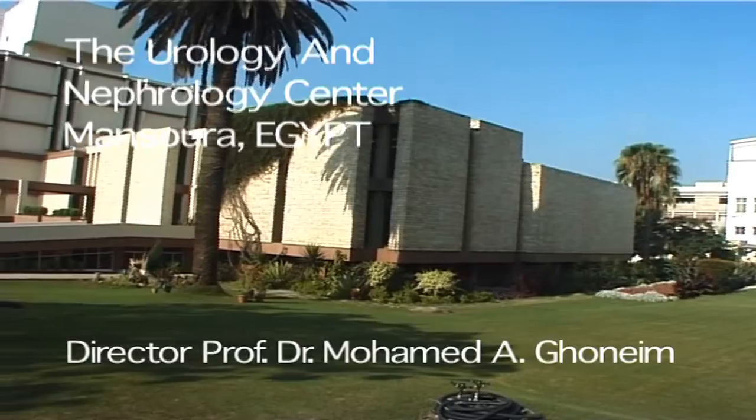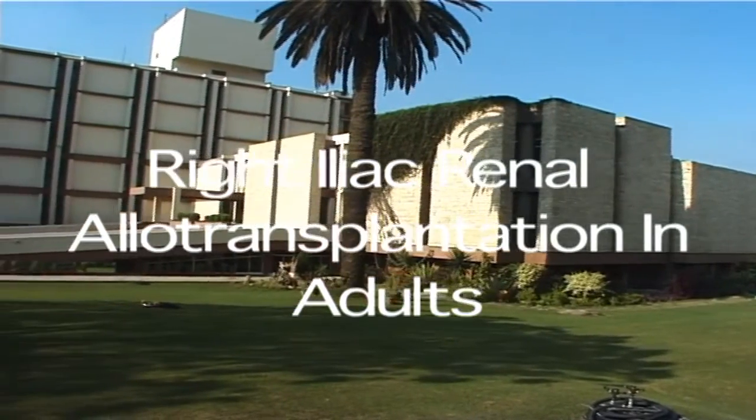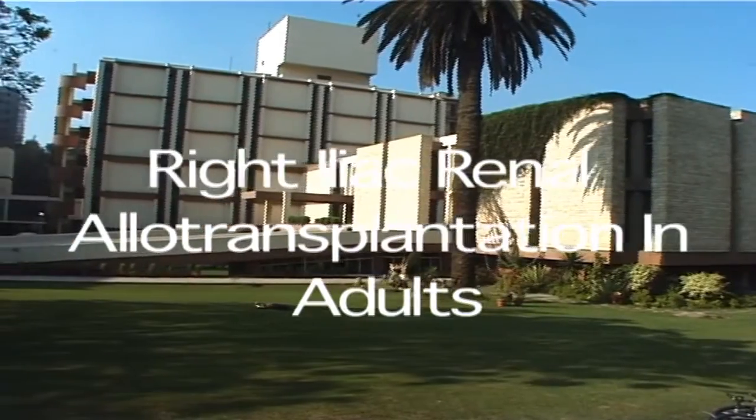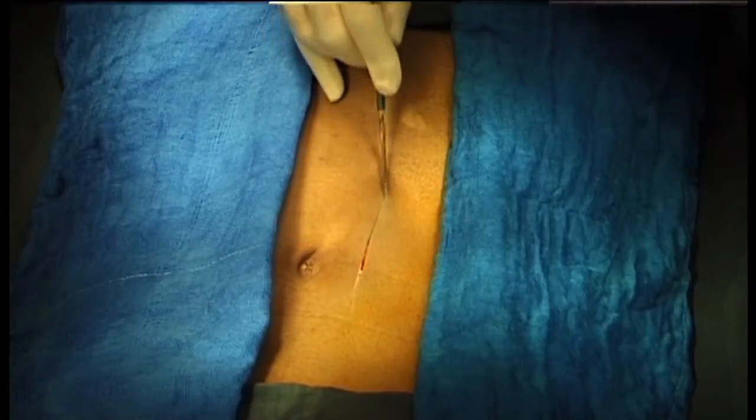Right iliac renal allotransplantation in adults. A pararectal extraperitoneal approach is carried out.